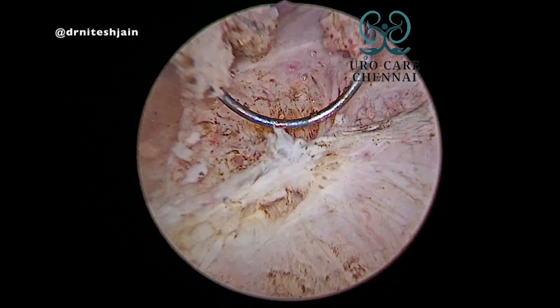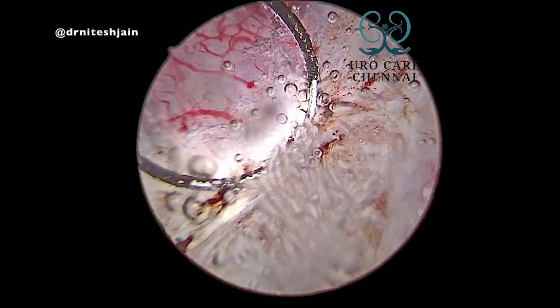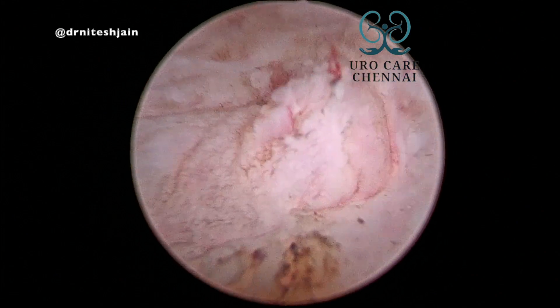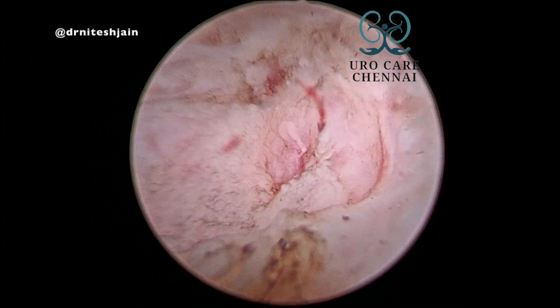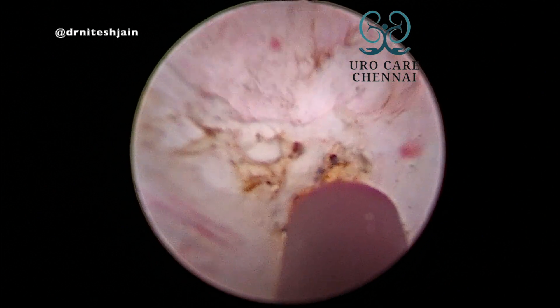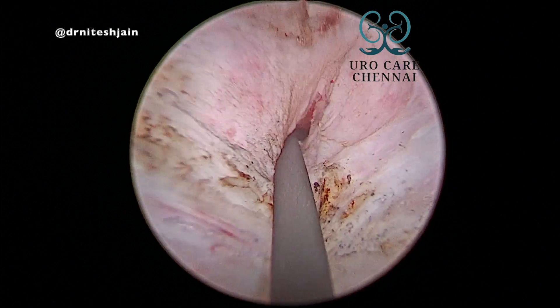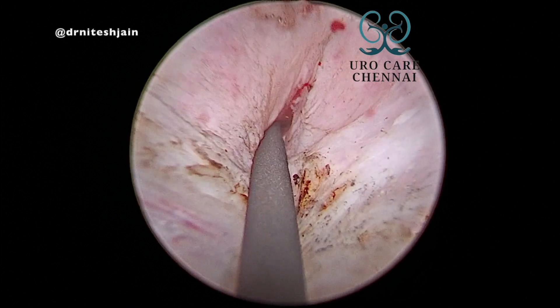Once that is done, try to identify the VUJ. You can see most of the time a pouting structure on the floor. You can see here how well it is pouting. Once that is identified, insert a guidewire and put a stent there.